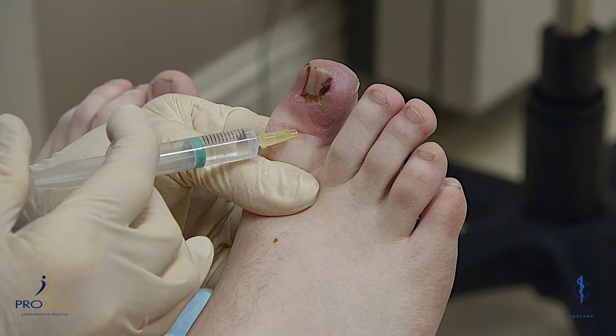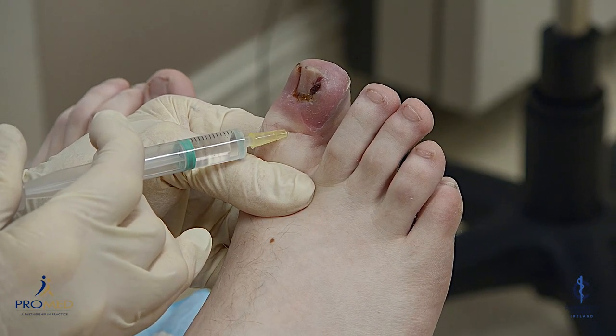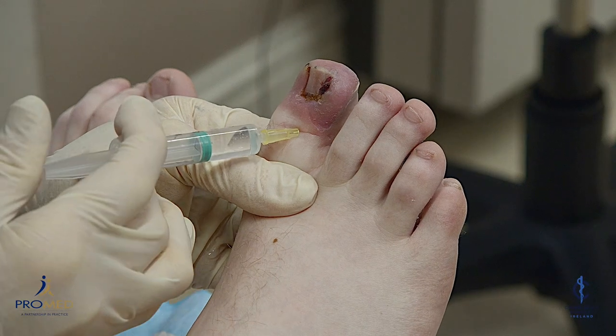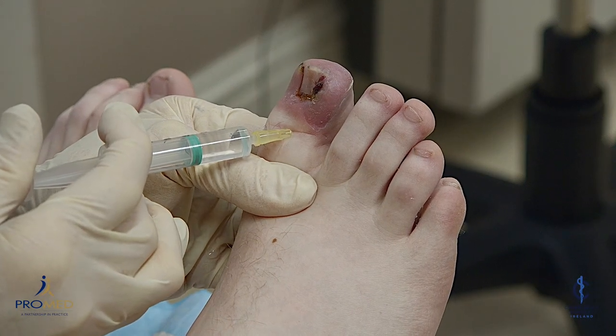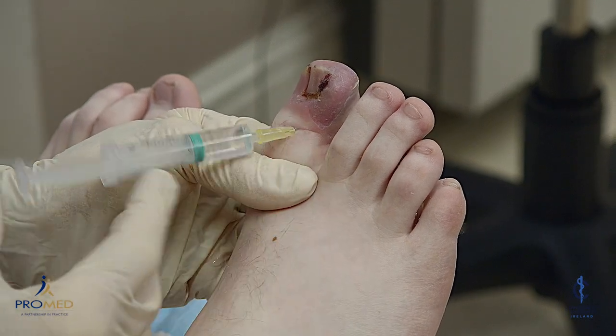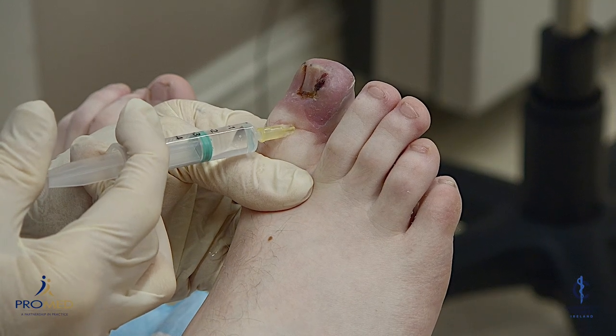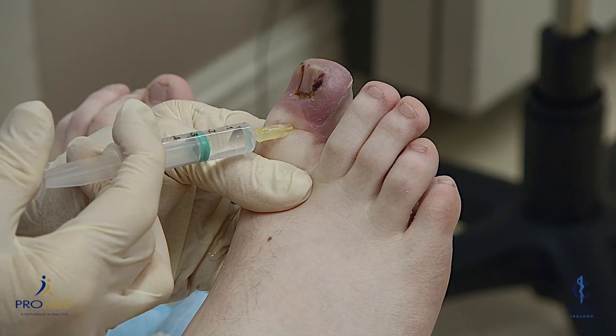One ml down the side here again. A lot of pressure. You have to make sure that the needle is attached to the syringe very tightly — otherwise it can blow back and squirt in your face, which isn't good.